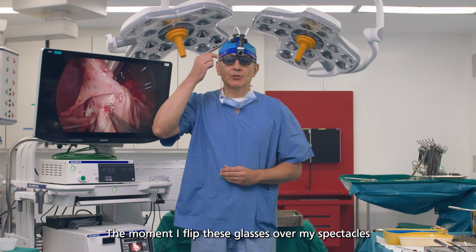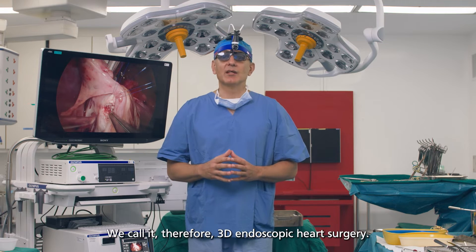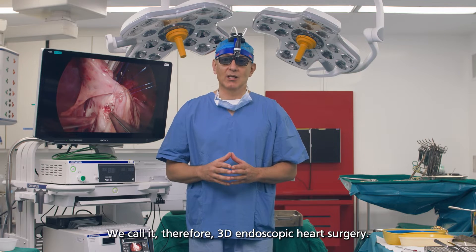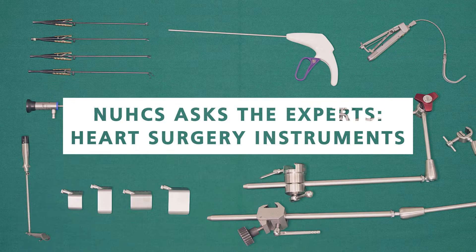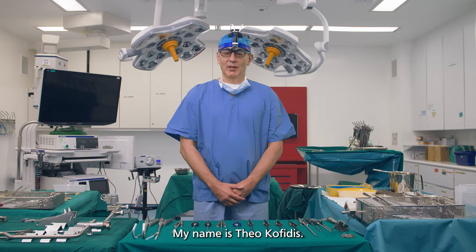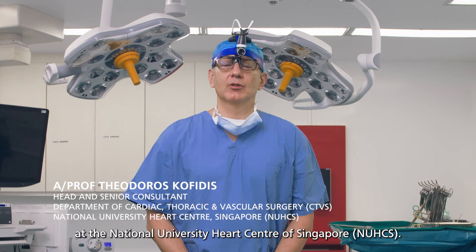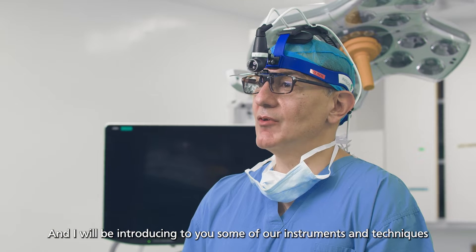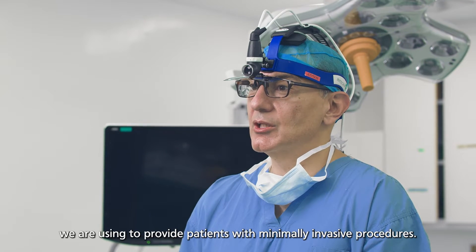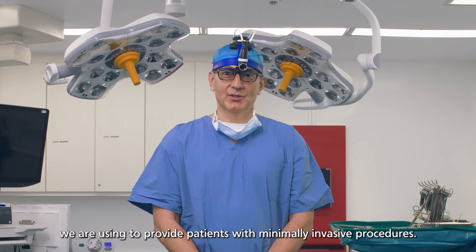The moment I flip these glasses over my spectacles, I can even see three-dimensionally. We call it, therefore, 3D endoscopic heart surgery. Good morning. My name is Theo Kofidis. I'm the head of the department of CTVS at the National University Heart Center of Singapore, and I'll be introducing to you some of our instruments and techniques we're using to provide patients with minimally invasive procedures.